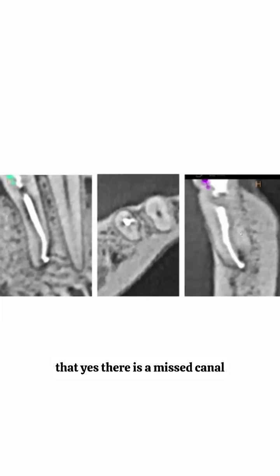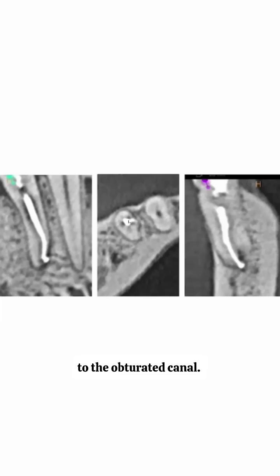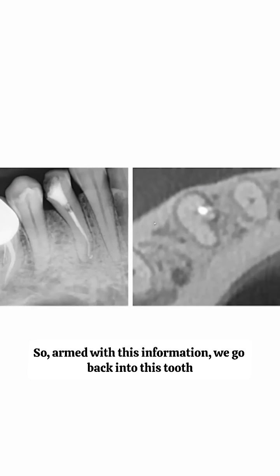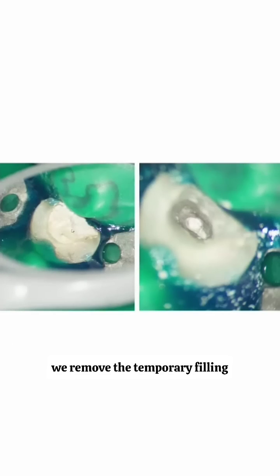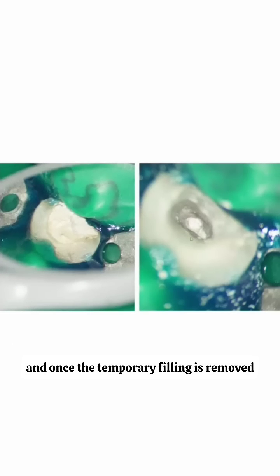What the cone beam CT tells us is that yes, there is a missed canal or root, and the missed root is lingual to the obturated canal. Armed with this information, we go back into this tooth and remove the temporary filling.